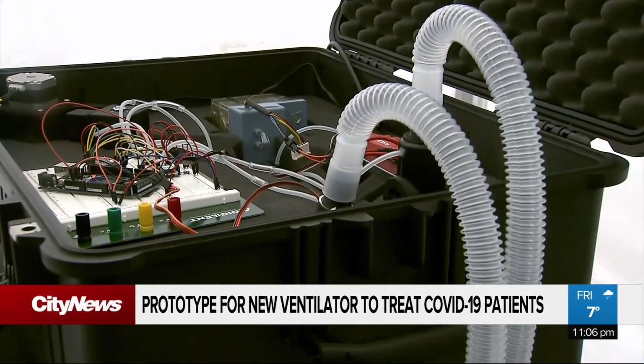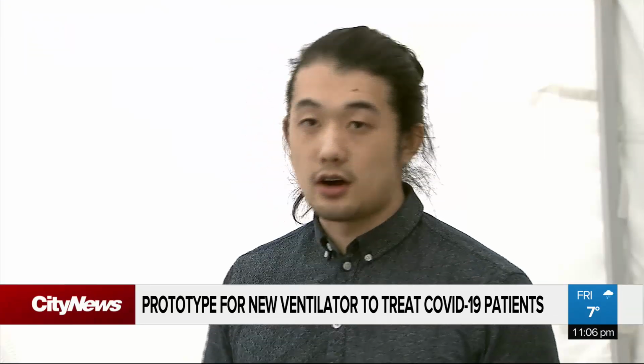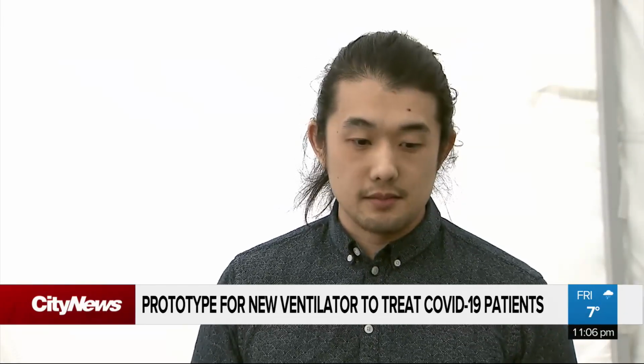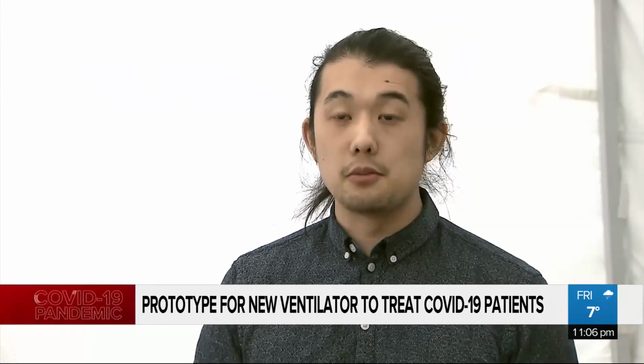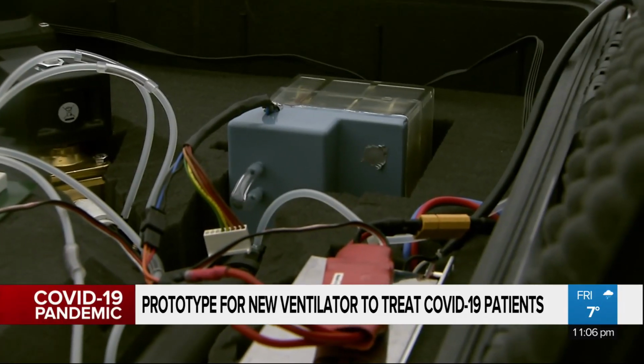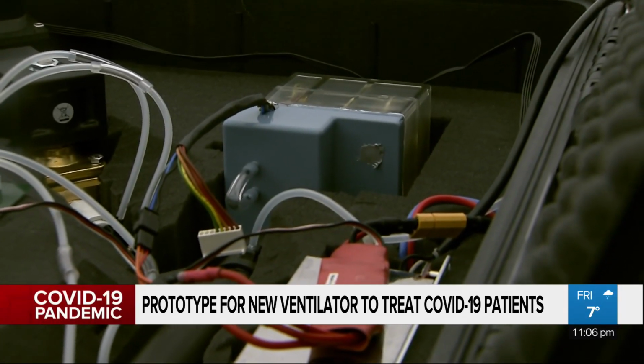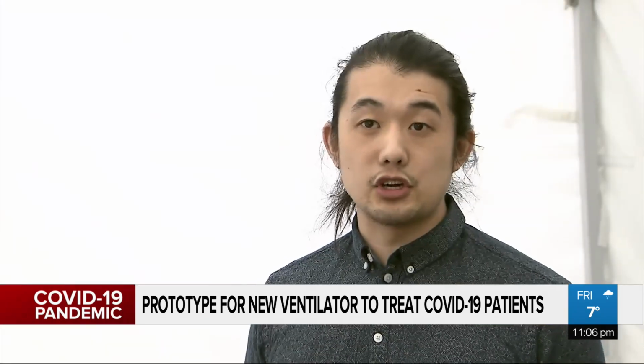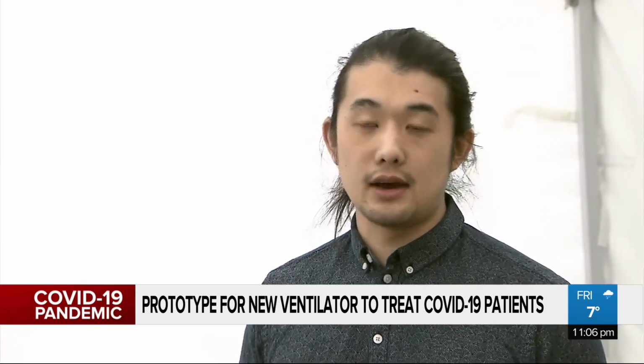We came up with a ventilator that used as much off-the-shelf componentry or things that we could build ourselves in millions during a pandemic without medical supply chain. We made sure that every part we use, they already make hundreds of millions of, so we can get a couple million of them. And anything that we couldn't find, we've designed in-house.